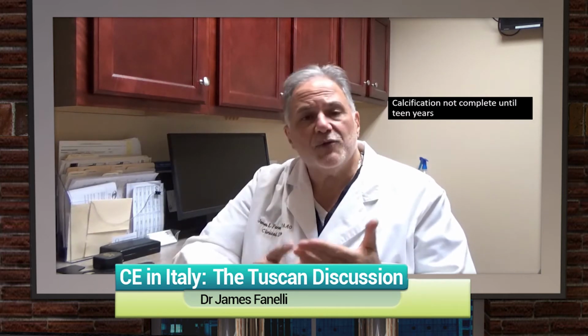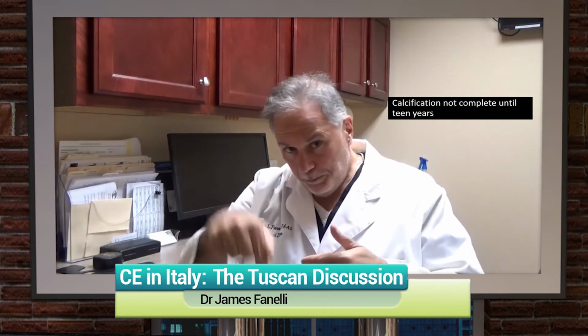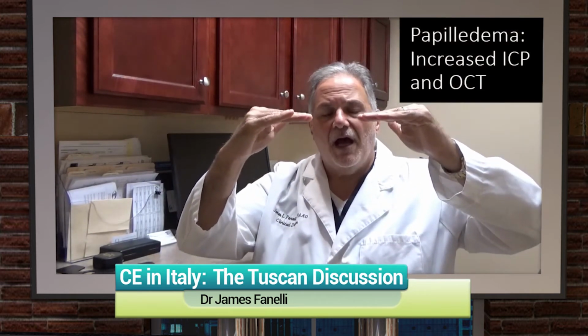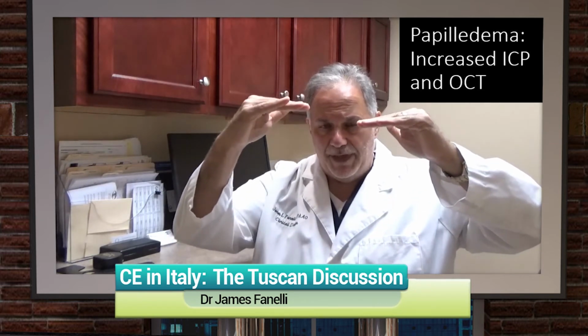That's important because one of the highlights of fundus autofluorescence is that you can see calcified drusen. But in those patients who have buried disc drusen or who have disc drusen that are not calcified, again, we're going to use our OCT. We're going to take our radial scans, and there are a couple of differences between those scans and that which we see in papilledema. Number one, there's not going to be a deflection of the Bruch's membrane RPE complex.